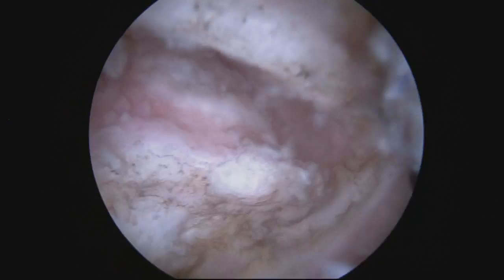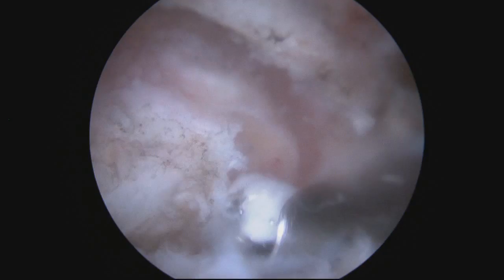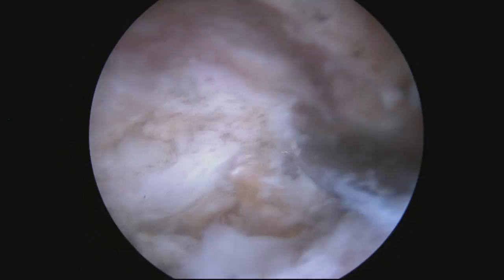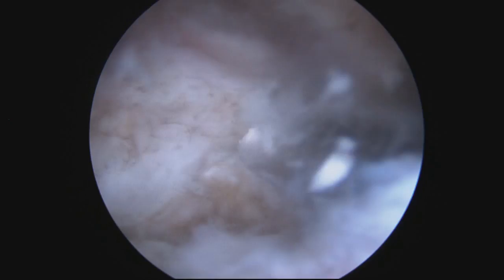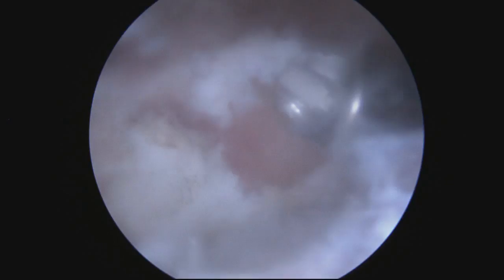We're going to bring in a burr — this is about 5 millimeters. We'll take off about 5 to 7 millimeters of the distal clavicle. I start by burring a trough to set the depth of resection, going all the way from the front of the clavicle to the back.